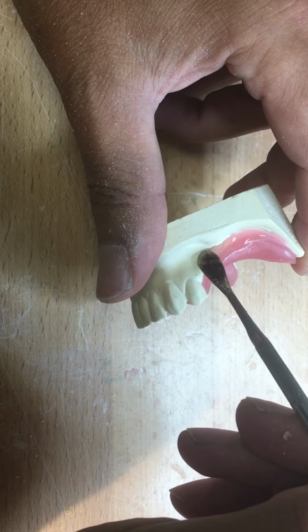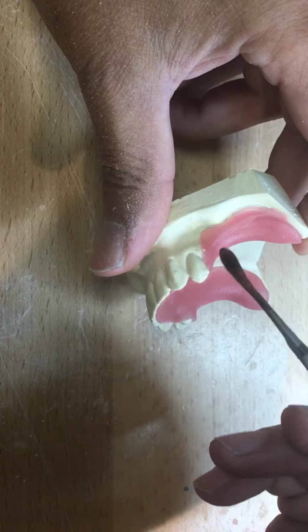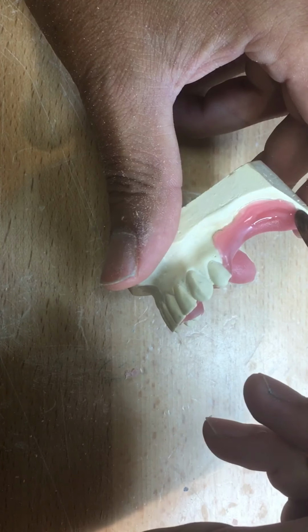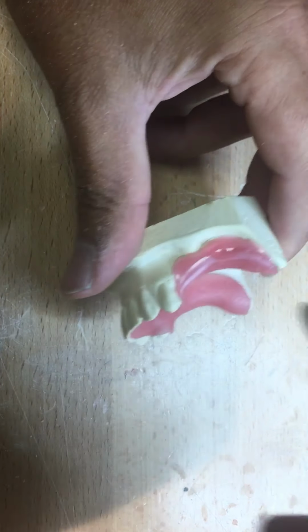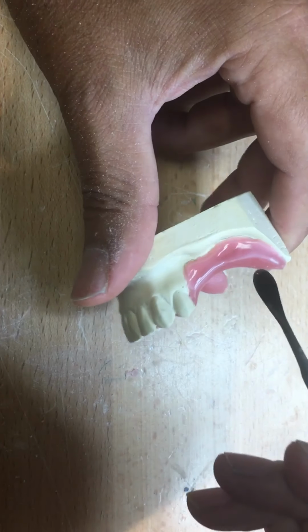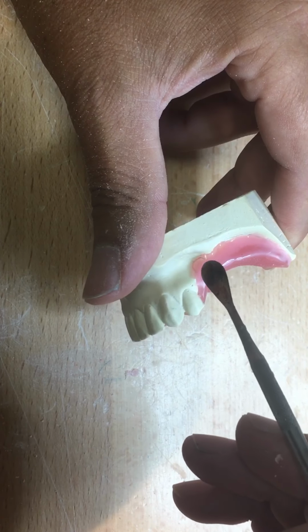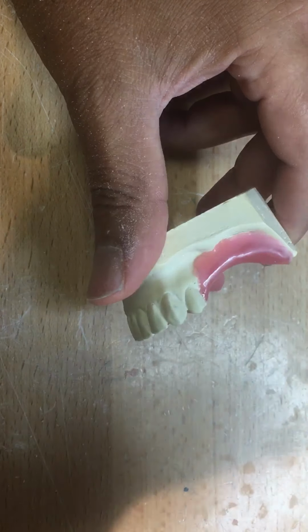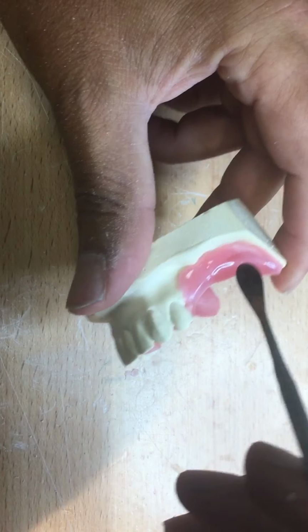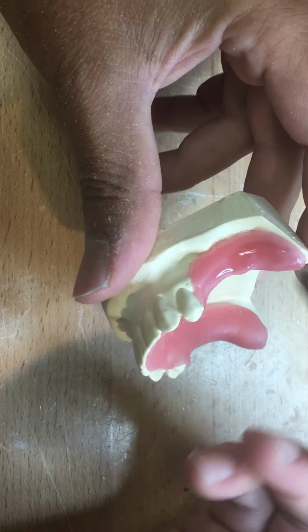So there's a lot riding on the occlusion rim. Yeah, all $38. I'm just guesstimating. Is just as important as the final prosthetic. Fair or not fair, that's another discussion. That's just the way it is. For all you golfers out there, the 1-inch putt counts just as much as the 250-yard drive. The occlusion rim is equal to the importance of the treatment plan as the acrylic, the teeth selection, shade, and setup and function.